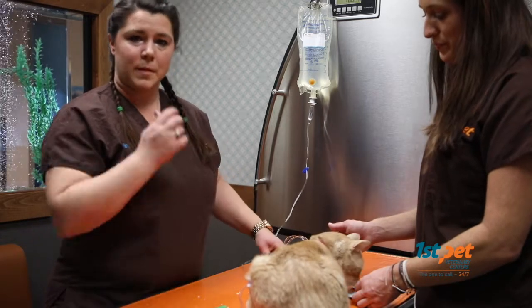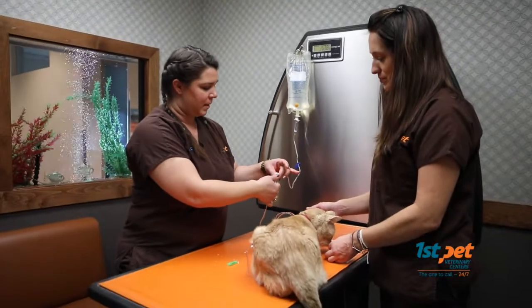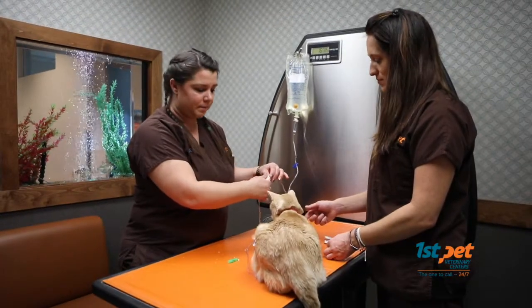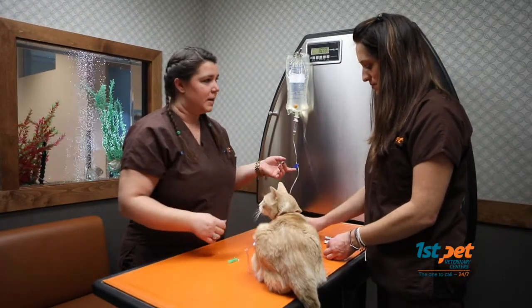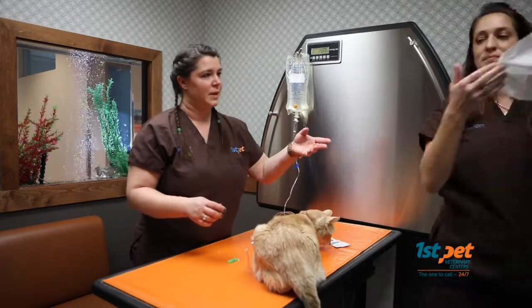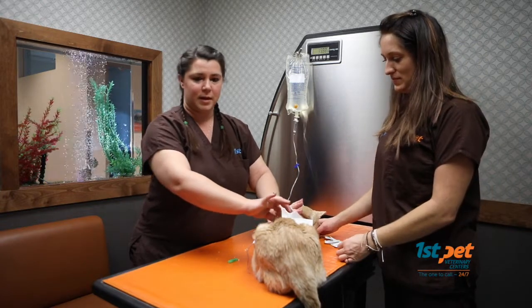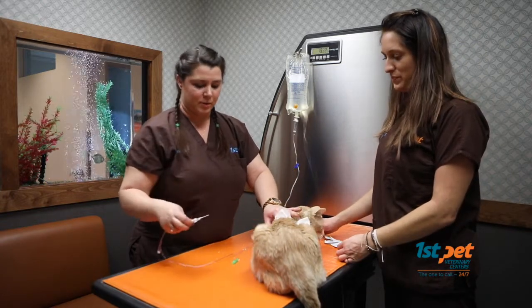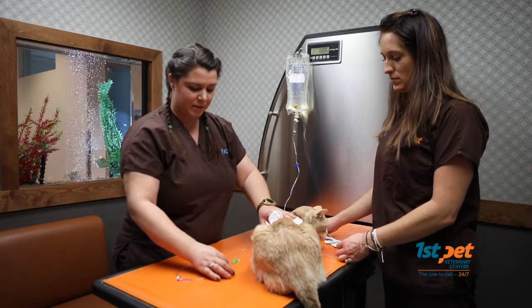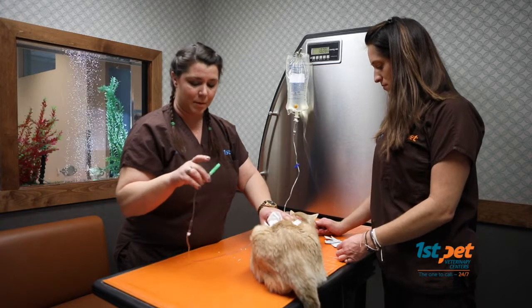When you're done giving fluids, we're going to roll down our clamp here. And I like to use a tissue at home. I'm just going to simply cover the area where the needle is, and pull it straight out. And I'm going to hold pressure where the needle was, and carefully put my cap back on my needle.